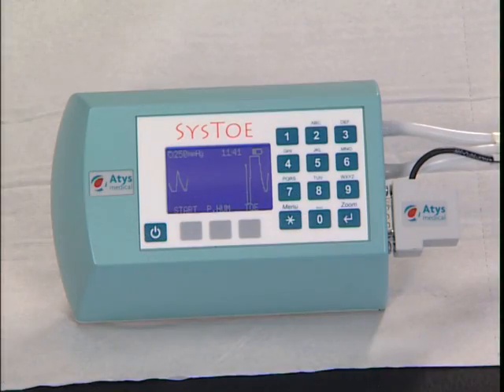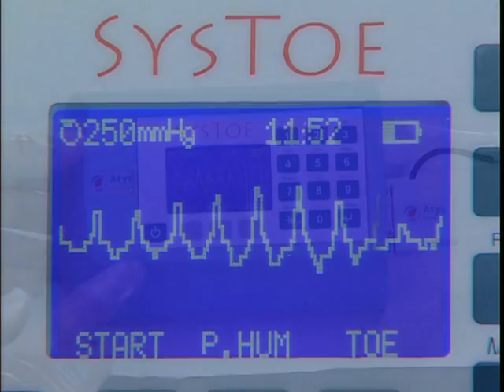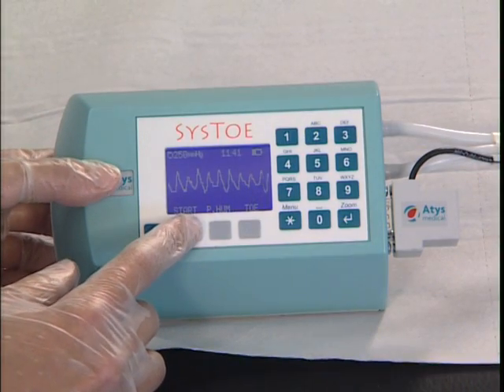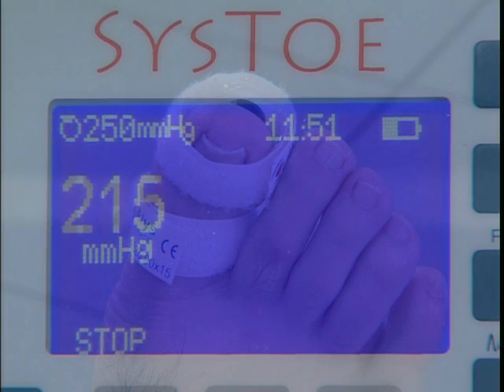The sensor sends an initial signal to the screen. This signal may be pulsed or flat. Start the measurement by pressing the start key. The occlusion cuff automatically inflates to a preset pressure, in this case 250 mm mercury.